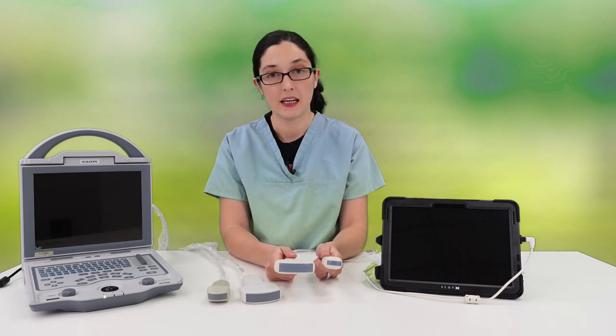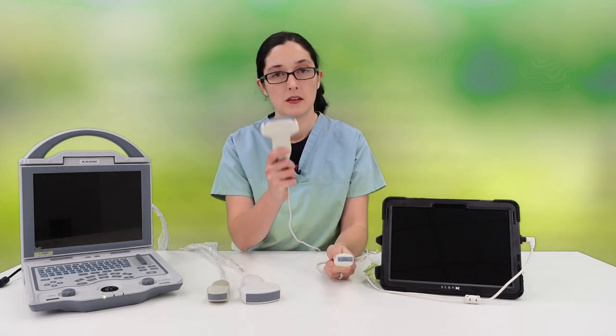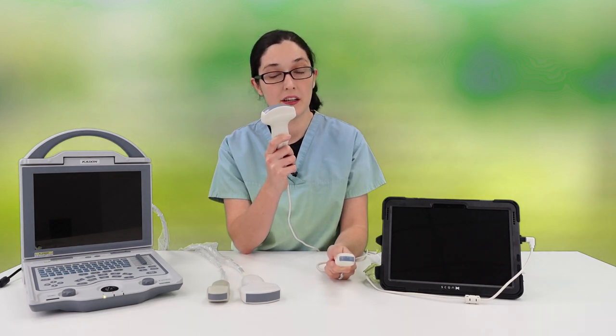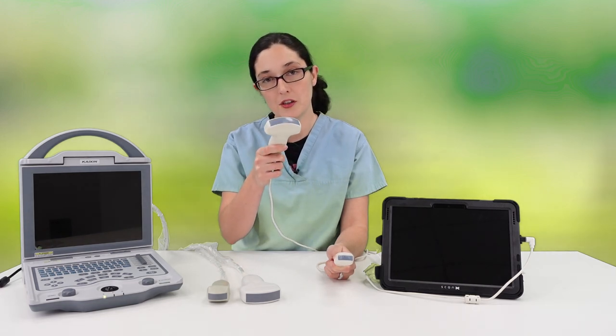The other consideration is the actual size of the probe. The microconvex probe is a lot smaller, making it easier to manipulate. The larger convex probe can give you a slightly wider field of view, but in smaller goats it can be difficult to manoeuvre.